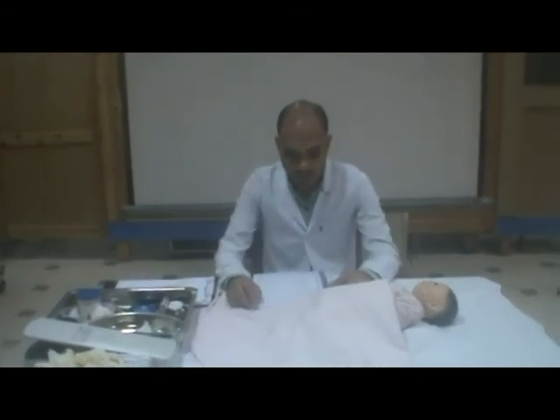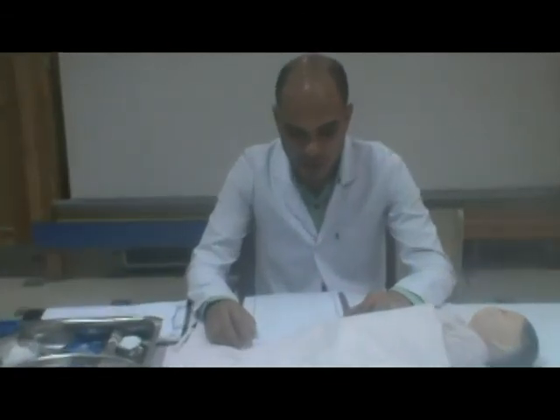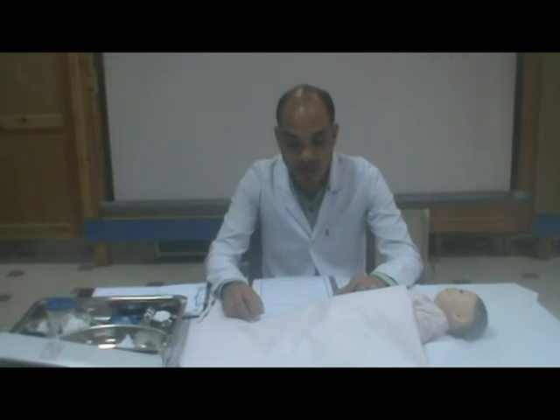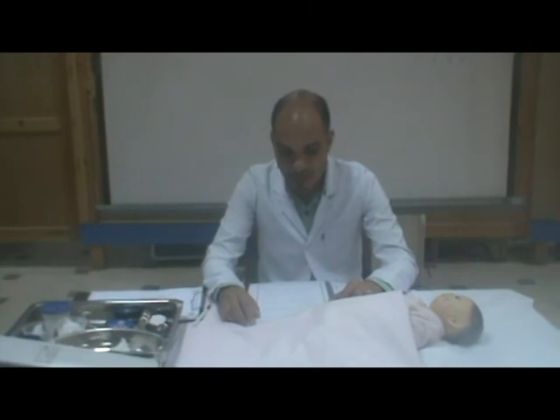Blood pressure. Blood pressure is the force exerted by circulating blood on the walls of the blood vessels, arteries and veins during each heartbeat. Blood pressure varies between a maximum systolic and a minimum diastolic pressure. Systolic pressure, the peak pressure in the arteries during the contraction phase of the cardiac cycle, can be measured as the point when sound can first be heard during deflation of the pressure cuff. Diastolic pressure, the lowest pressure, can be measured at the resting phase of the cardiac cycle.